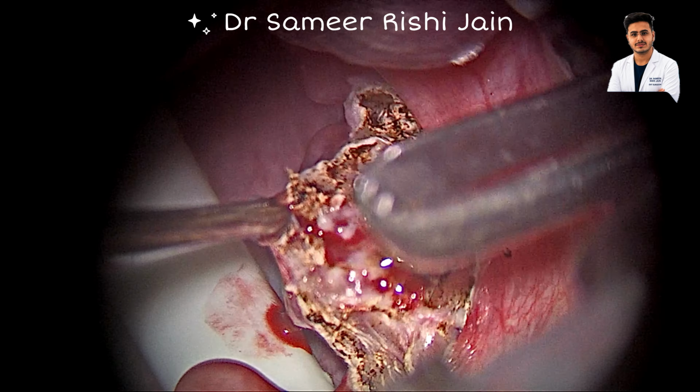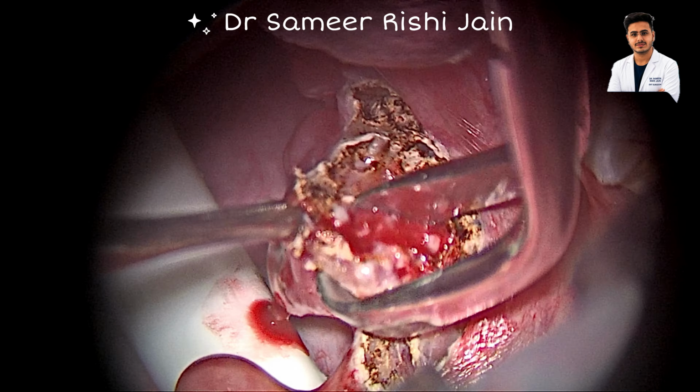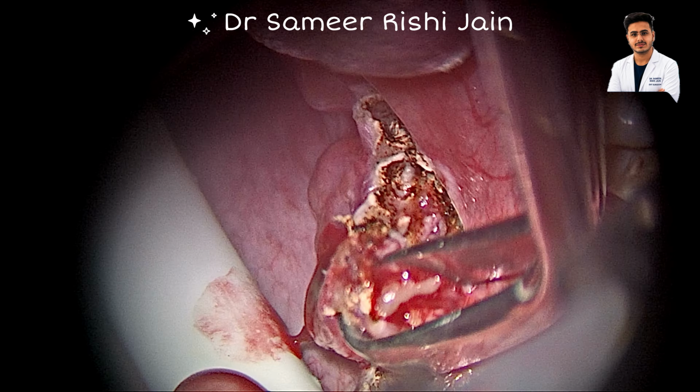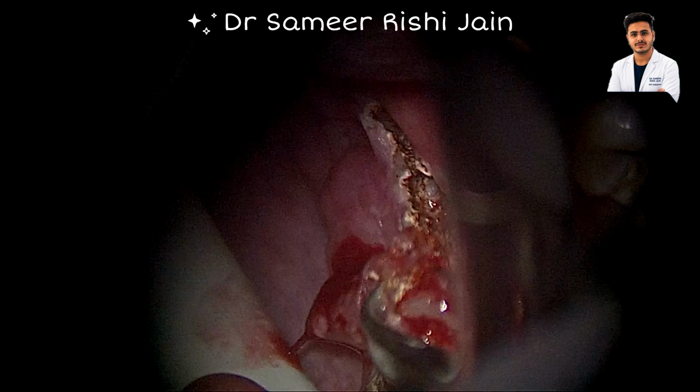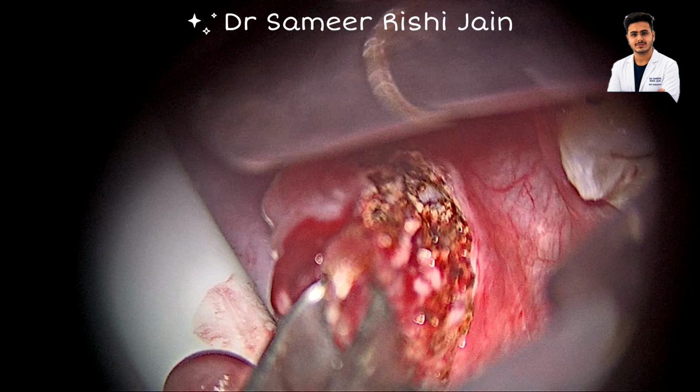As you can see, there is very minimal bleeding from the tonsil. Even though we are using the monopolar cautery and not the coblation, we can still do a relatively bloodless surgery with the help of a monopolar cautery.